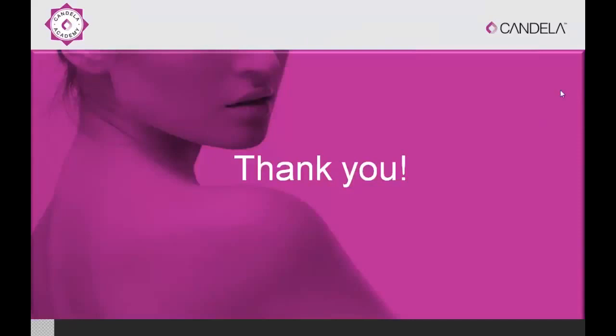There is one question about changing the depth of the LIOBs and its impact on the results for wrinkles and acne scars. That's a very good question. It is not so much the depth of the LIOBs as it is the number and size of LIOBs. That is why we do multiple passes with higher energies, to get larger and more numerous LIOBs, and that gives us more of a wounding effect.